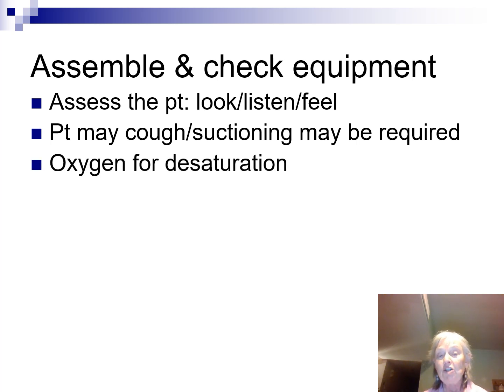Oxygen for desaturation, because sometimes if these patients are on oxygen, we need to get these trachs cleaned, and we need to make sure there's oxygen available so that they have their oxygenation.